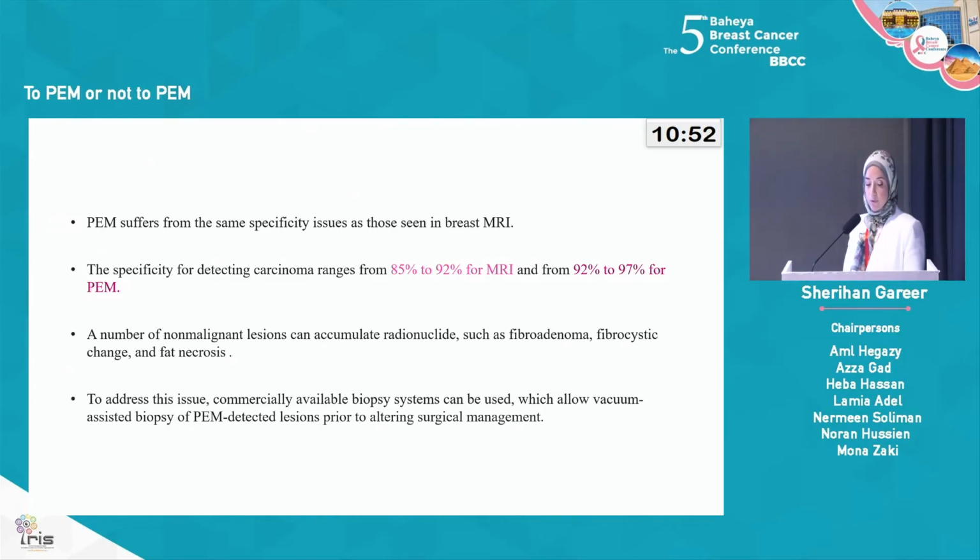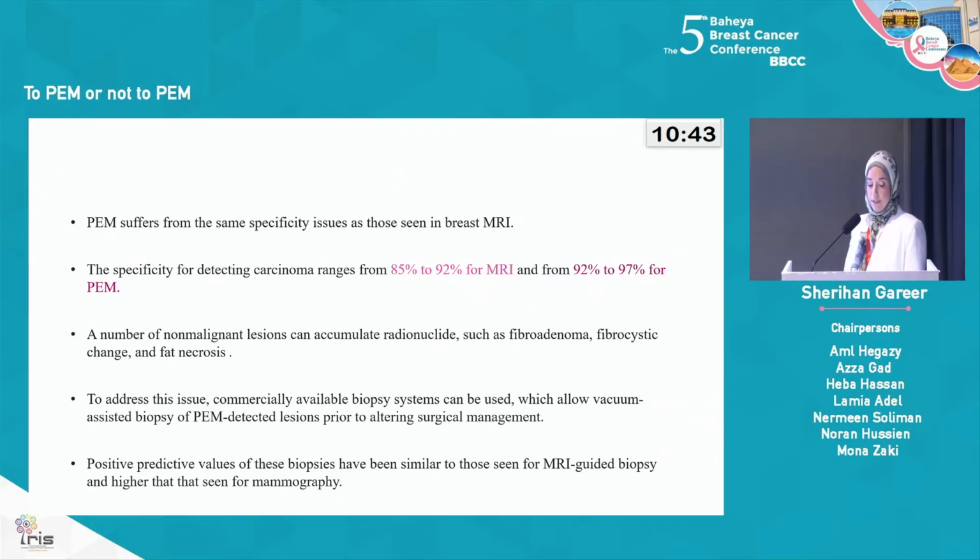And to address this issue, commercially available biopsy systems can be used, which allow vacuum-assisted biopsy of PEM-detected lesions prior to altering surgical management. The predictive value of these biopsies has been similar to those seen for MRI-guided biopsy and higher than that seen for mammography.